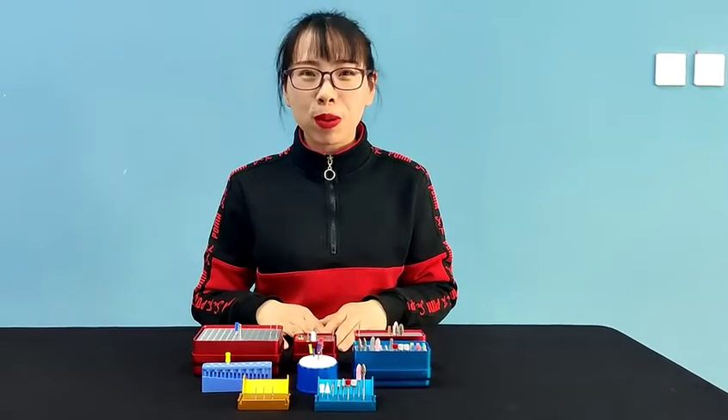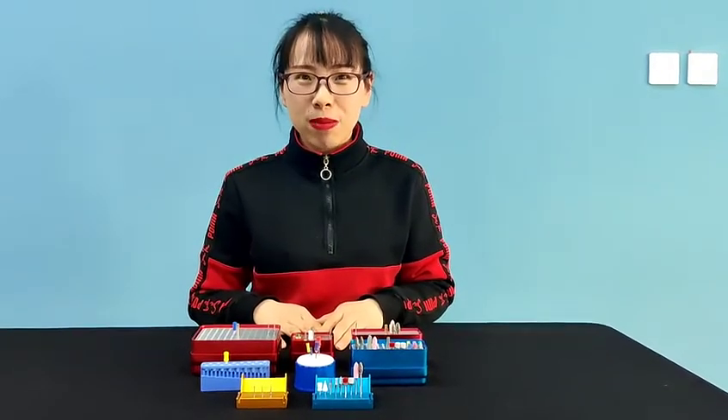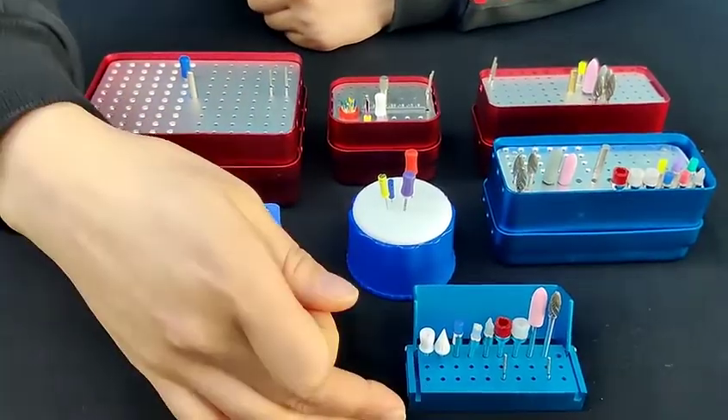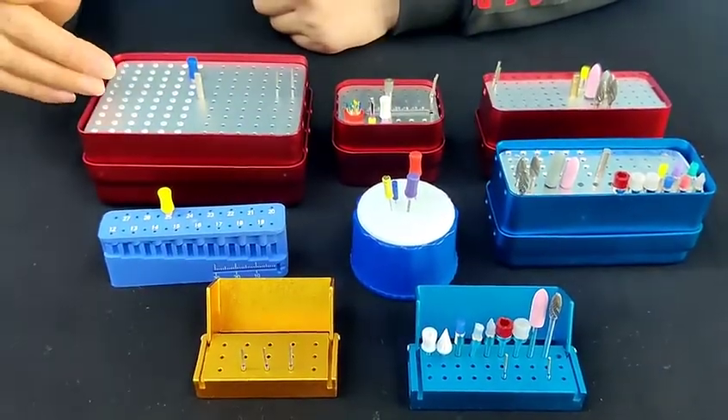Now it's time for the dental burr books. Here I will show you the details. There are many different types: 50 holes, 30 holes, 72 and 120.